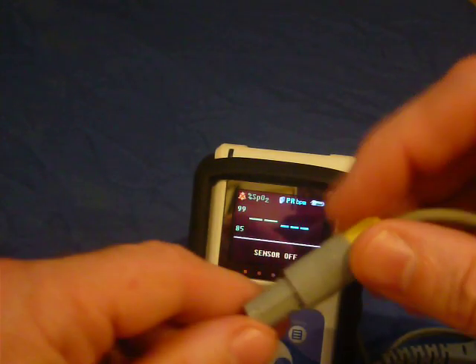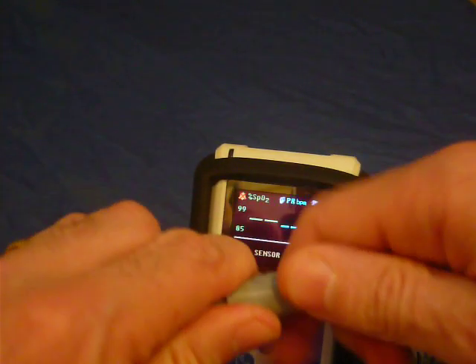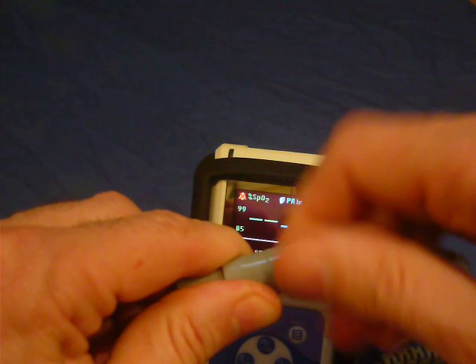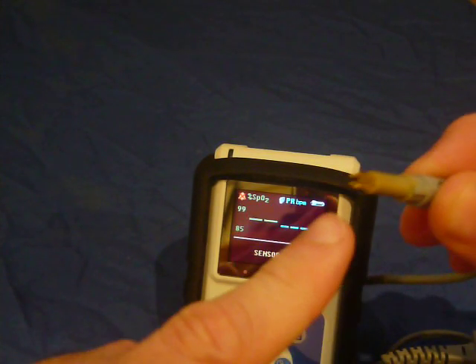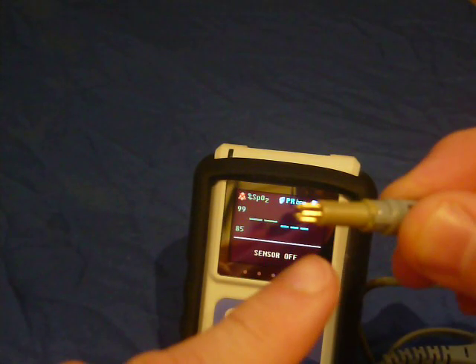If the pins become bent, the yellow connector can be disassembled like this and the pins bent back gently. Note that all the pins are gold plated.